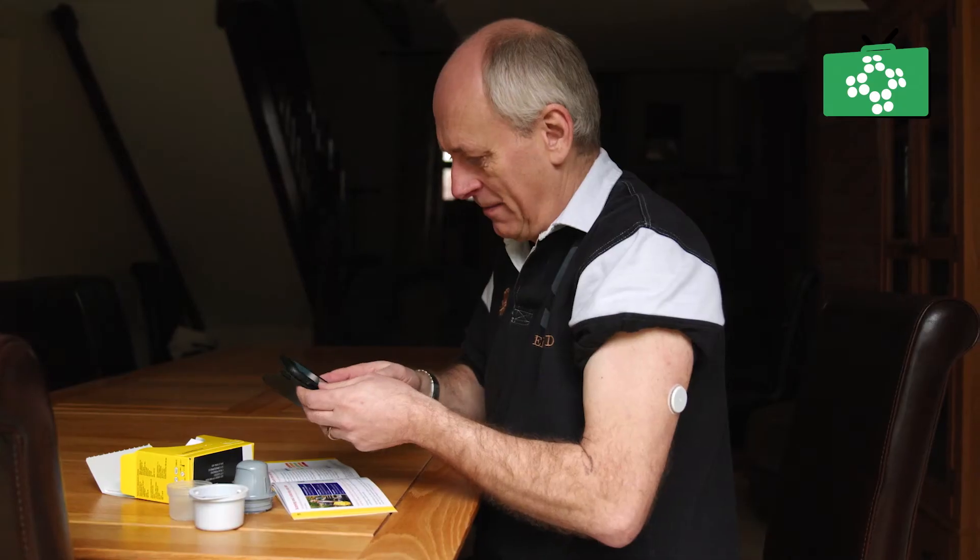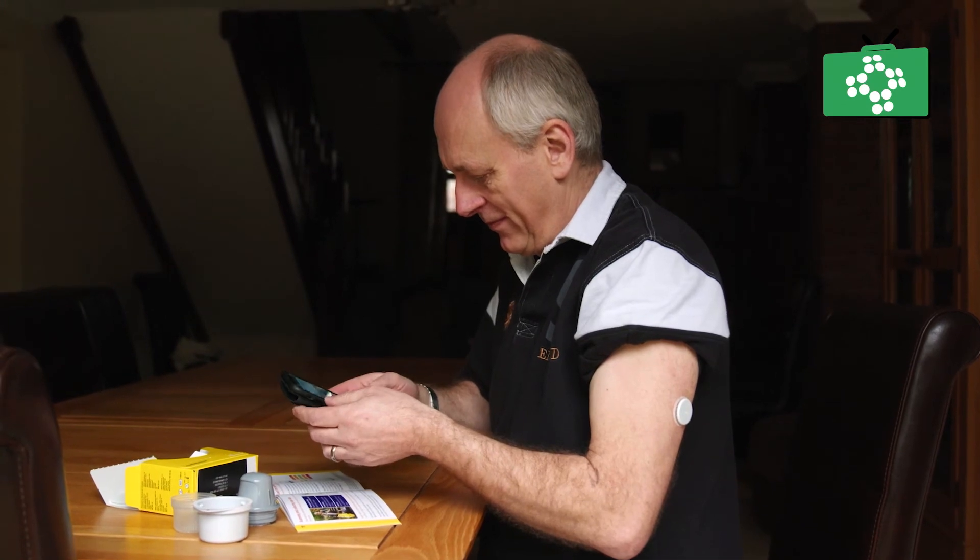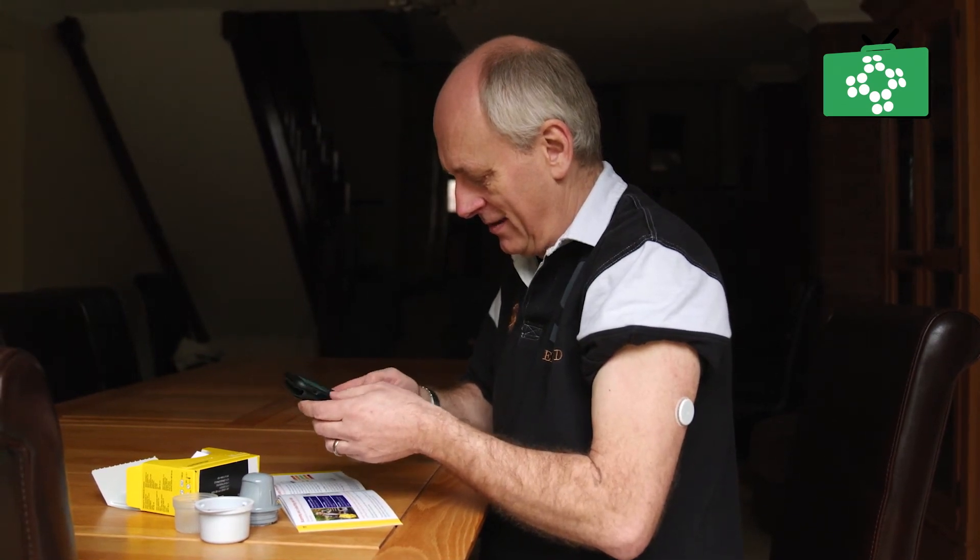Follow the instructions on the app to register your sensor. The sensor is now ready to use. After a short time it is ready to take your first reading. The app or reader will tell you when to take your first reading.